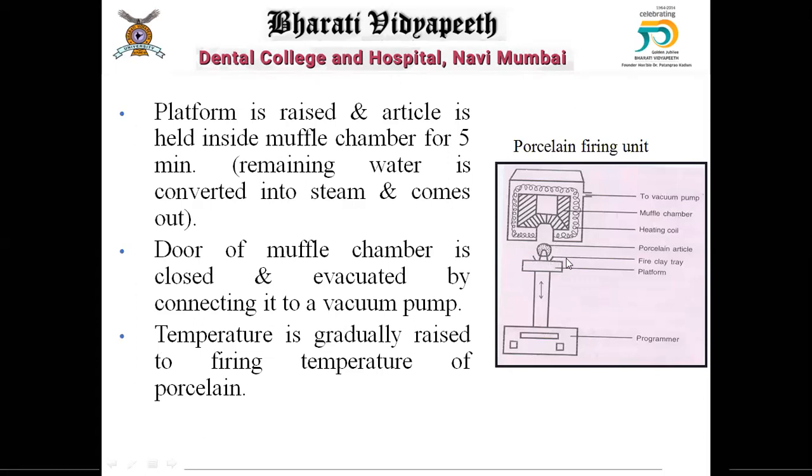Okay, it is all automatic. Once you place the article, or the crown which you are preparing here, the platform automatically goes inside the furnace. Then the door closes, and all the excess air is removed with the help of the vacuum pump. The furnace is connected to the vacuum pump. The temperature increases gradually.